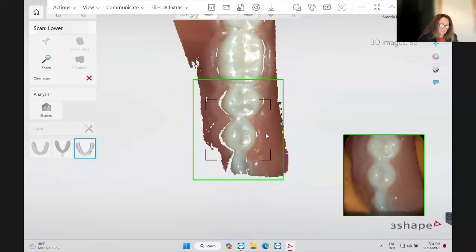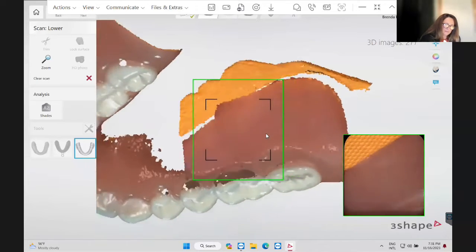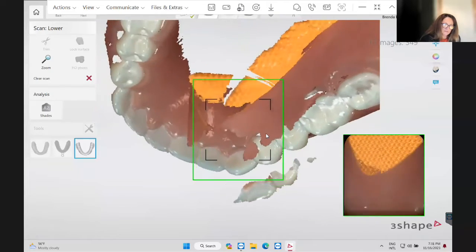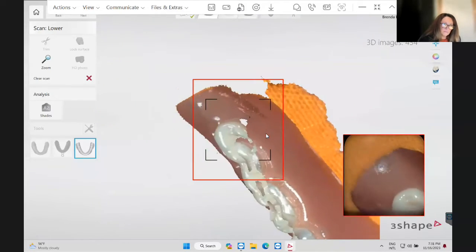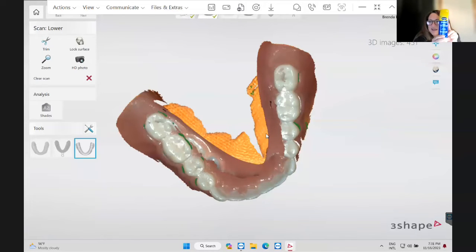So I'm gonna sit this down here. I think I'm having all that light reflection. And this is perfect timing for this, Kelly, because we were told at one of the dental schools to use spray foot powder on a denture, so you will not have that glare. Right now I have, like we say in a dental office, your loop lights on, or the overhead light on. I have two bright lights for my camera. So I'm just gonna spray this and we will see how that responds.